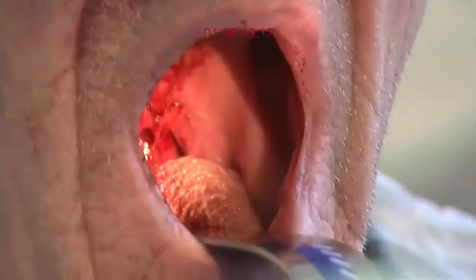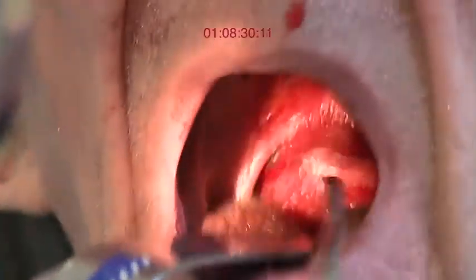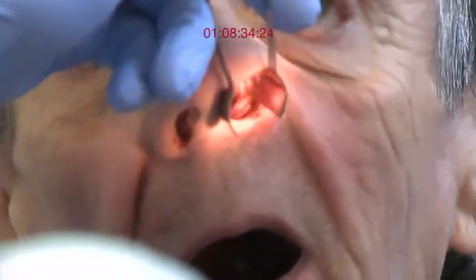While the spray is working, examine the back of the throat to see if there are any blood clots which should be removed using the McGill's forceps or suction. Examine the nose to see if you can identify a bleeding point, looking carefully at Little's area. The appropriate treatment depends on your findings.